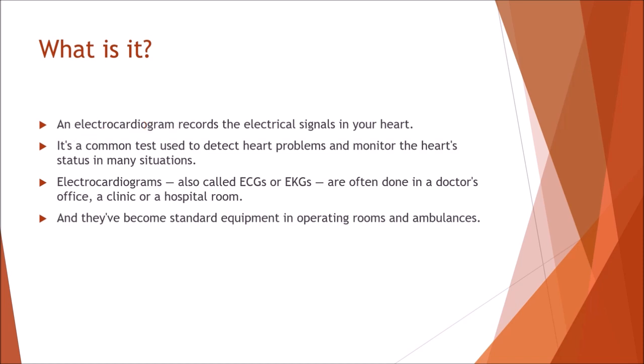The way I usually explain it to a patient is it's an electrical picture of the heart, okay? And what does it do? It detects arrhythmias and basically heart problems. Now, you might hear it referred to as either an ECG or an EKG. They both mean the same thing. And we use pretty standard equipment in order to take the image.